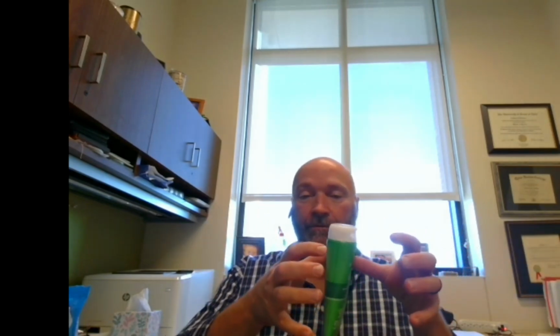So the elevated side, all the ribs close up, and the side closest to the image receptor, the downside, so to speak, is open so that you can see the ribs. So now if we have a fracture in the axillary portion of the ribs, that's basically the lateral side of the thoracic cavity, then you're going to be able to see those fractures a whole lot easier, right?